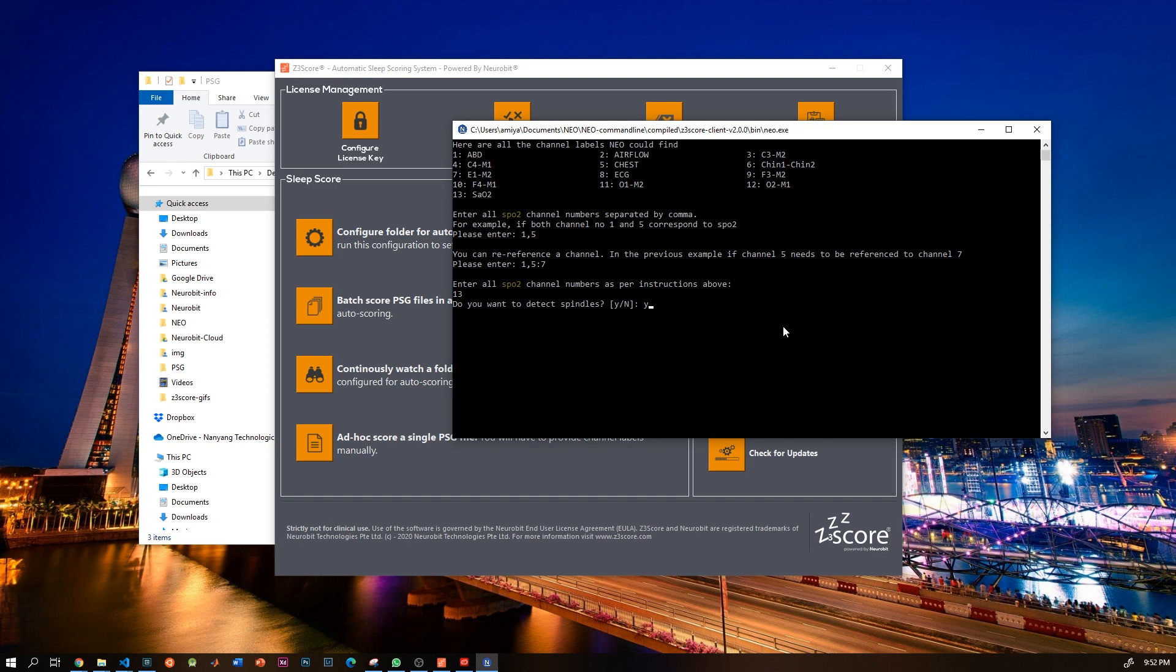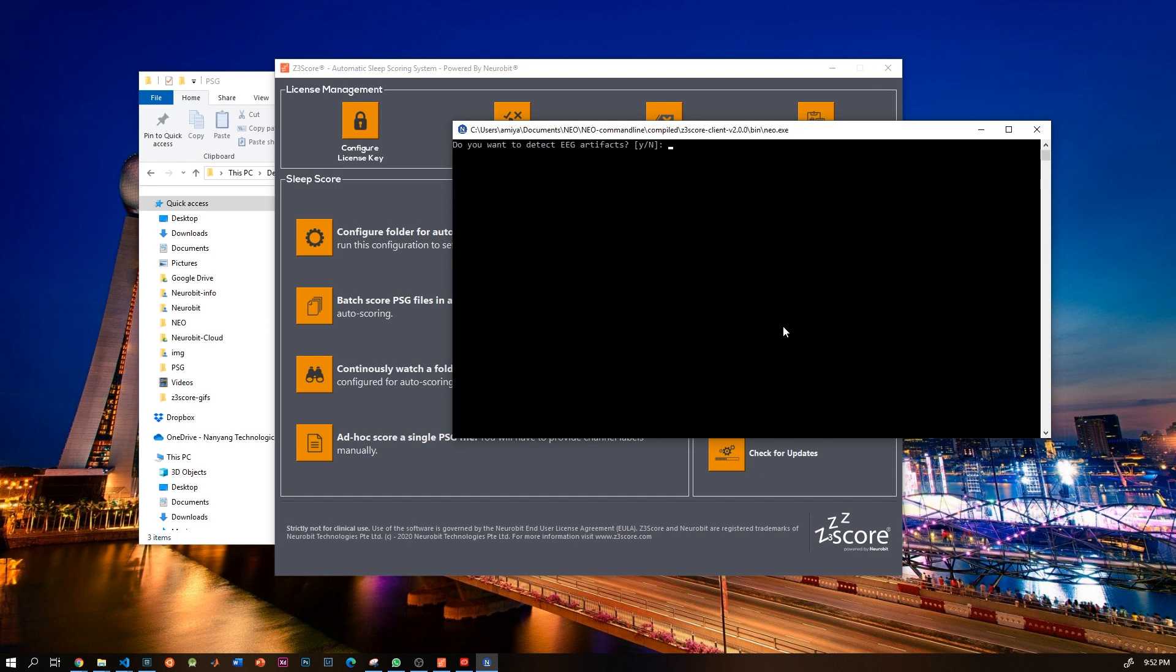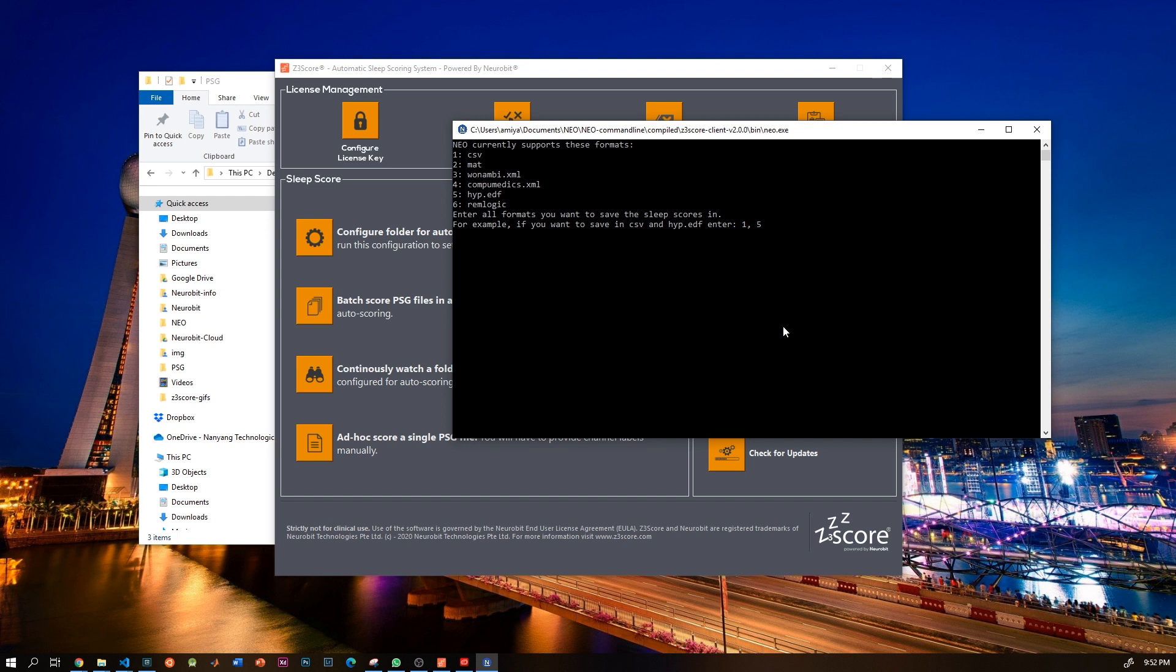Well, I do want to do this, so I say yes. And then it asks, do you want to do artifact detection? And again I say yes. Once you are done, it will ask you which formats do you want to save the sleep scores in.